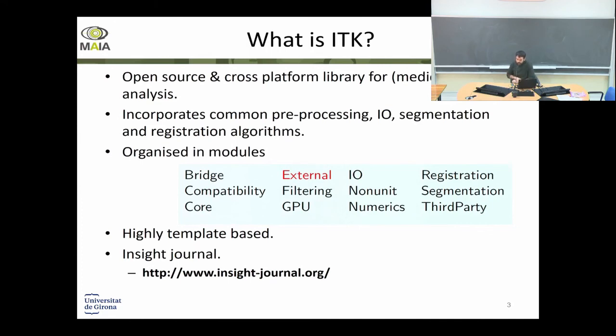It's an open source and cross-platform library, as I already said, for medical image analysis. The idea was to do it for medical image analysis, but you can do any image analysis that you want. And it incorporates different modules, from pre-processing, input and output, to segmentation and registration. Do you know what registration is? Yes?